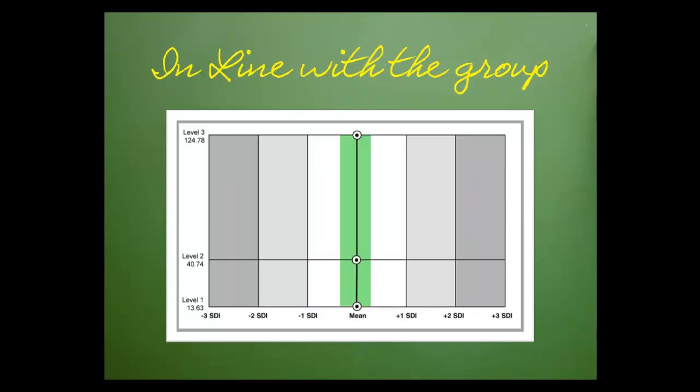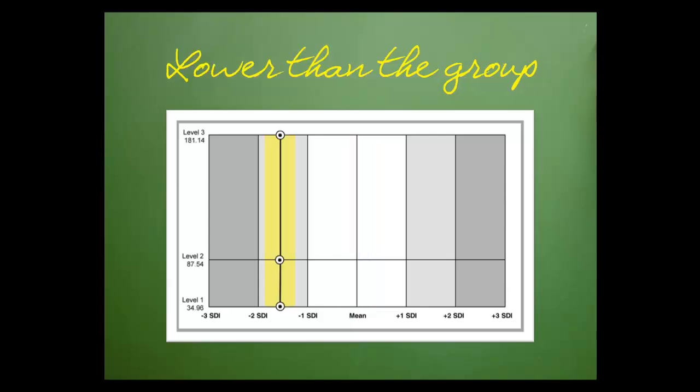The position of the line also provides information. The closer the line is to the center, the better. This indicates that my lab is getting what the peer group is getting. If the line is off to the left, I'm lower than everybody. If the line is off to the right, I'm higher than everybody.